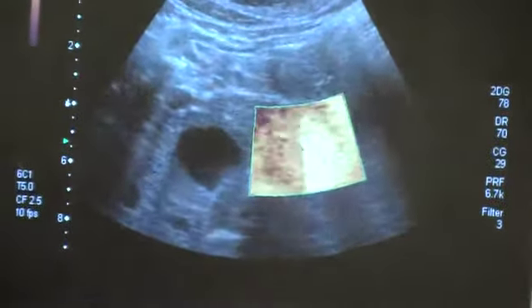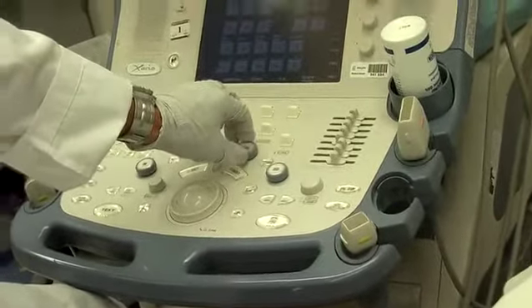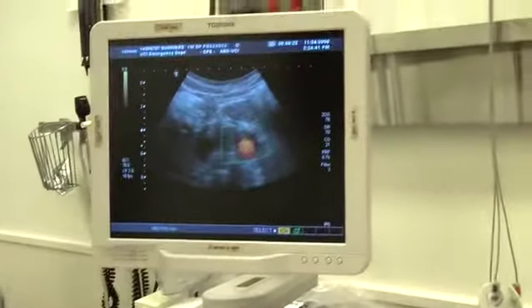Yeah, the problem is our patient is just a little too wiggly over here. And yeah, she's just in a little bit of pain. So that's where we are. Always blame the patient whenever you can't get an image, exactly, by the way. So then we go back into color flow.